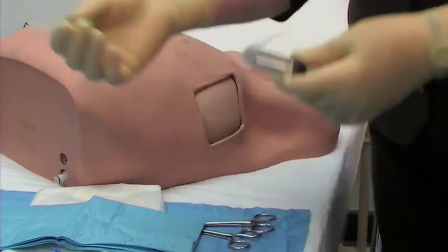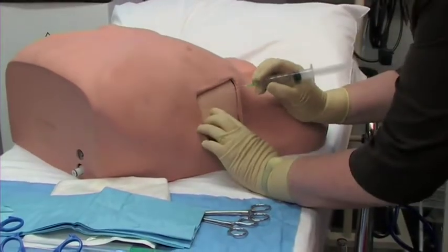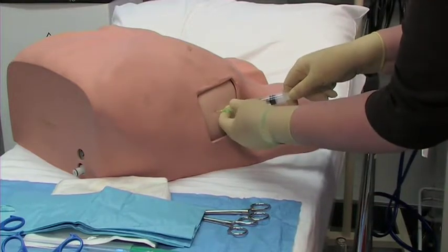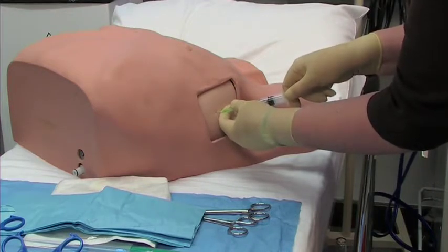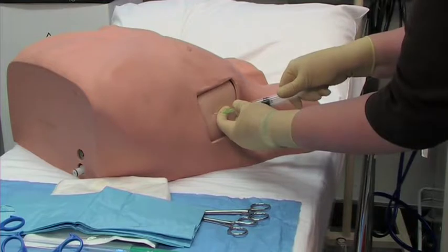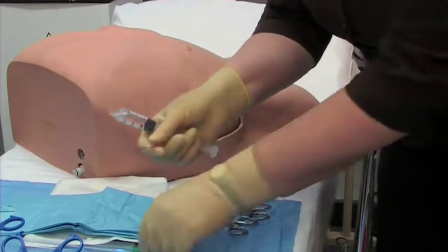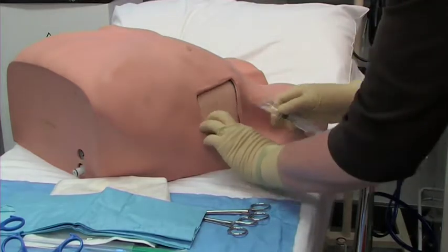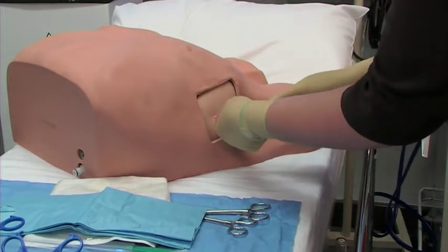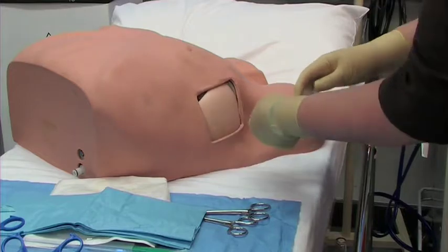Remove the needle and then attach the next size. Go in deeper into the subcutaneous tissue, again drawing back to make sure you're not in a vein, and gradually injecting. Then with the final needle, you're going to go in right to the level of the rib. You will feel the needle hit the rib, and just inject as you pull out from there.